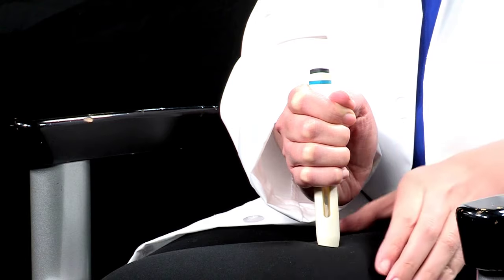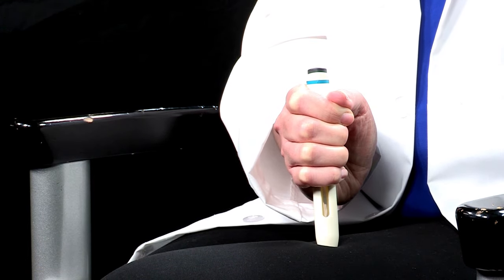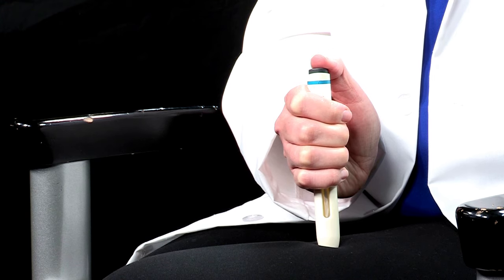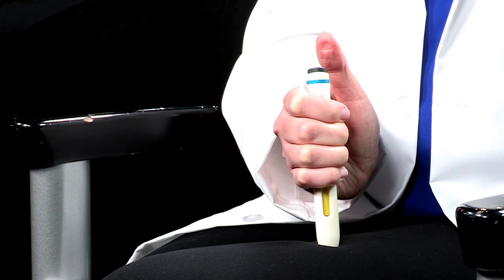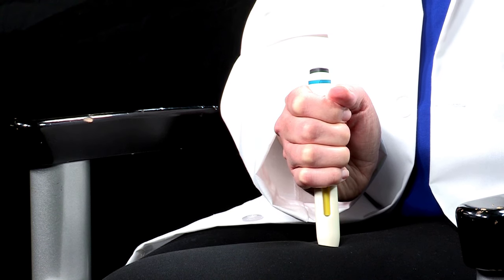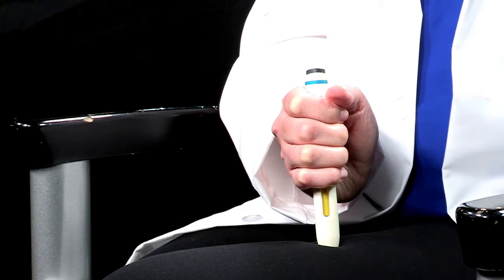If needed, pinch the skin to make sure the injection site is firm. While maintaining firm pressure on the autoinjector, click the green or gray activation button with your thumb and then release the button. The medication window will start to turn yellow. Make sure to keep firm pressure on the autoinjector against your bare skin after releasing the green or gray activation button. The injection may take up to 20 seconds. Check that the medication window has turned completely yellow. You may hear a second click.